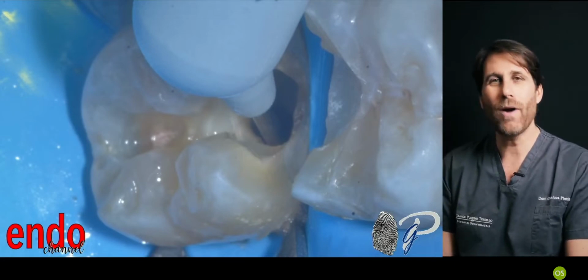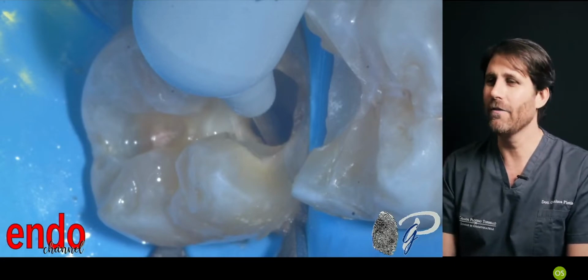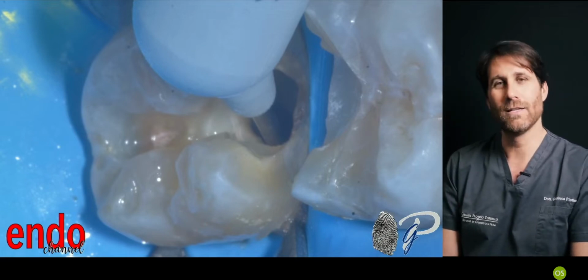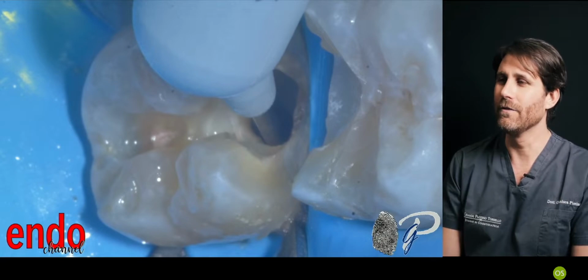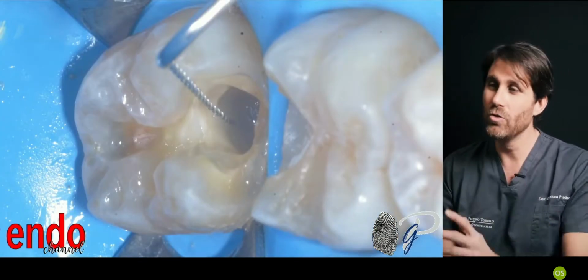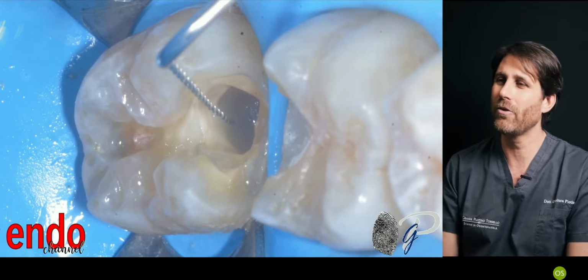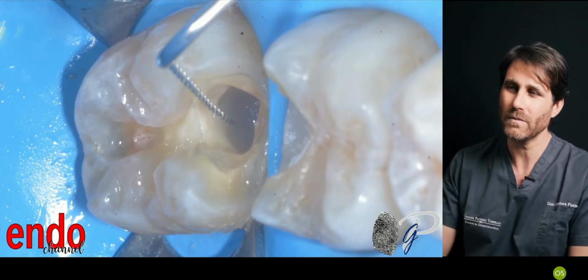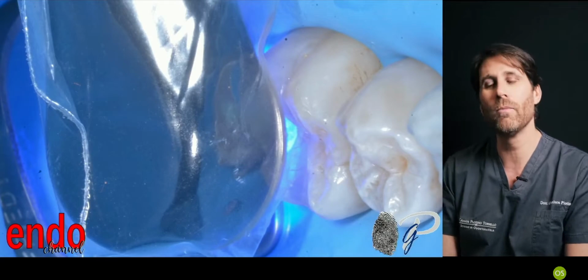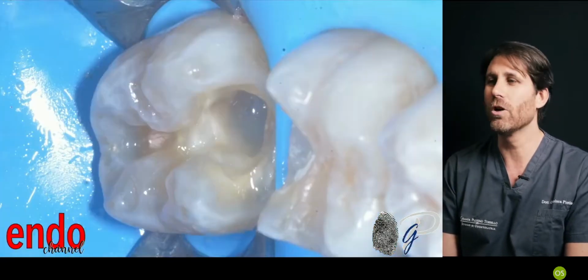There will be surprises in our endo channel in the future, not only endo, we will also speak about the restoration of endodontically treated teeth. Those are just some images to understand how to perform the restoration in these spaces. Flowable bulk fill composite, well distributed to reduce the possibility of including bubbles.